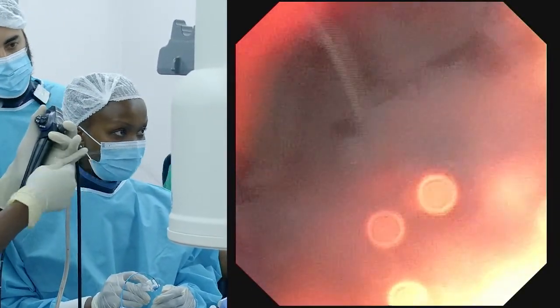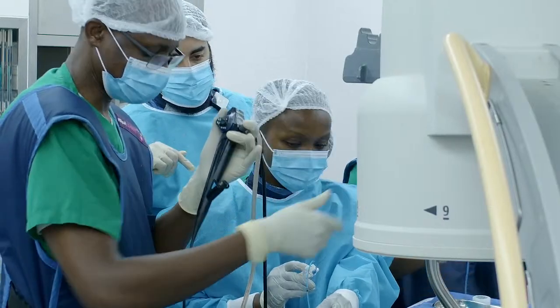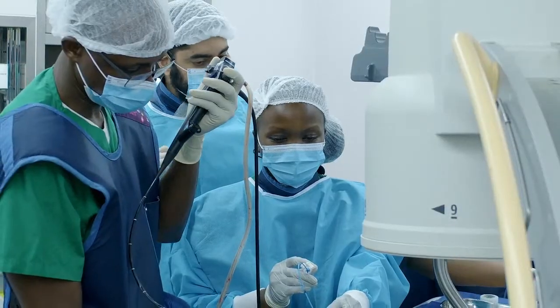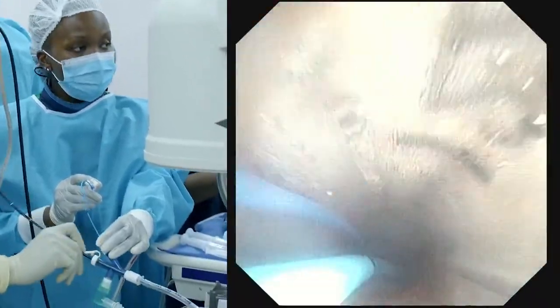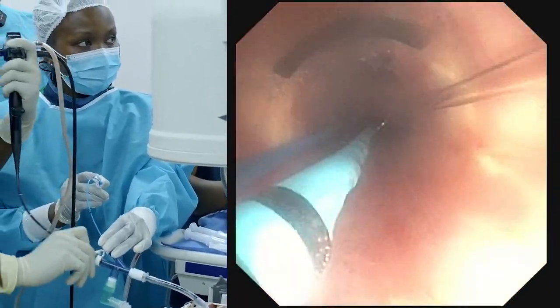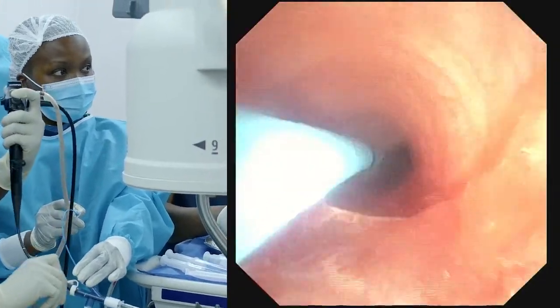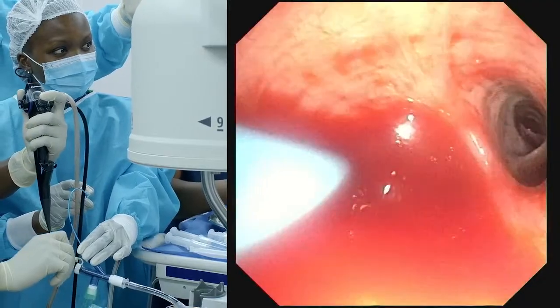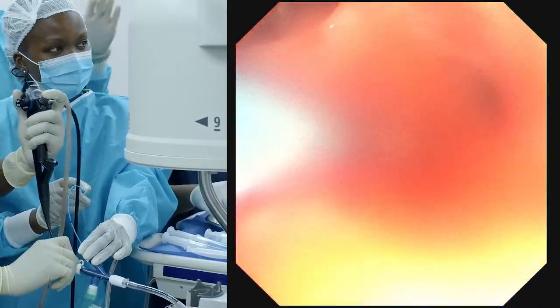Take out the cryo probe. Yeah, give it to. Probe out. Jackie, you've got the balloon in place. Now you're going to go back in quickly, check for bleeding. And you see, look, that's not badly placed. Now suction. Yeah, good.